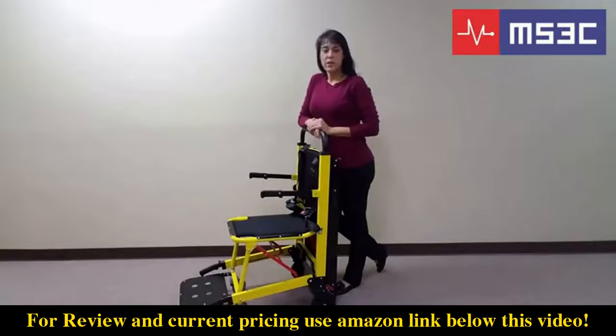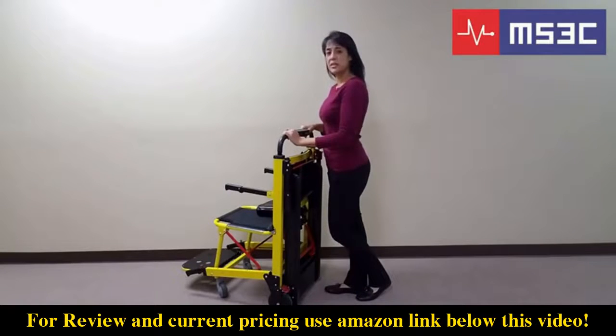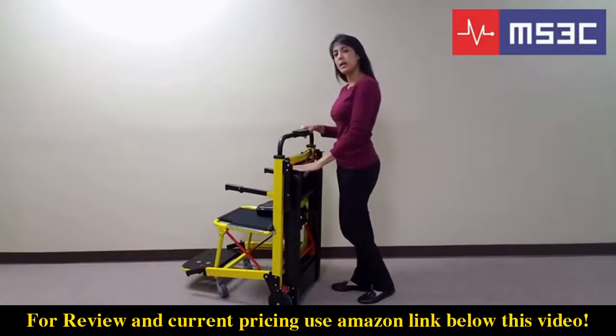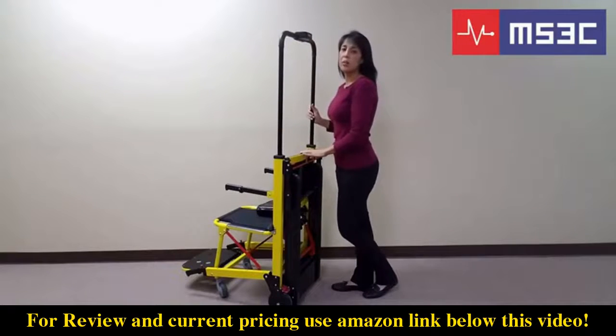Although the evacuation chair can be operated by a single individual, whenever possible a second individual should be engaged to assist with the process. These next steps will demonstrate the chair's basic operations. The telescoping guide bar will need to be adjusted into the full open position when ascending and descending flights of stairs. To extend the guide bar, push the red lever located horizontally across the back of the chair and lift. The guide bar will lock automatically into place.